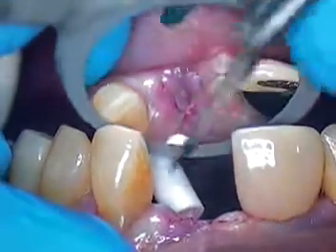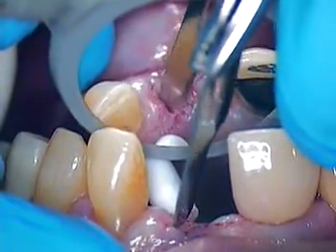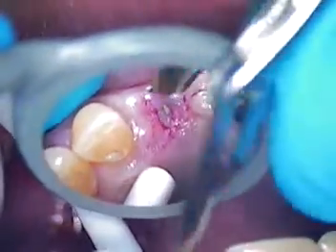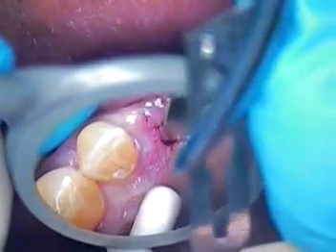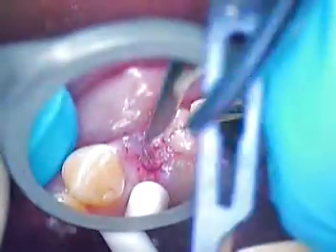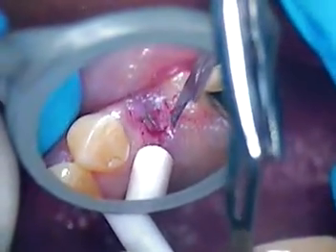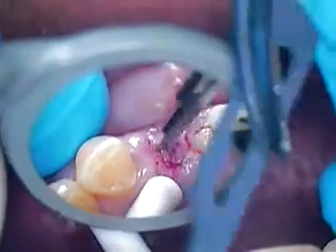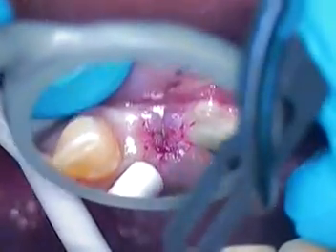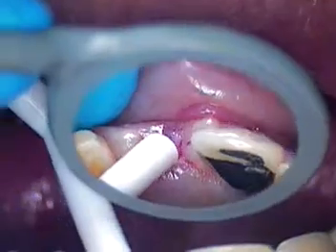We'll go ahead and finish this and then I'll come back after we clean it all up. We're going to do just a little U-shape incision. I'll take everything from the palate up to the facial so we preserve as much facial tissue as we can. We don't want to take away anything from attached gingiva, so we can afford to go palatally. I'll be right back to show you the cleanup on that and then we'll get right into the threads.